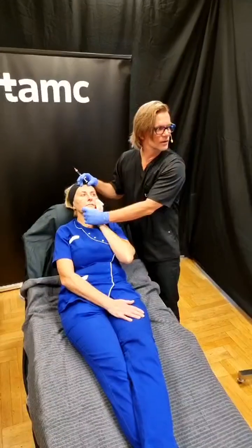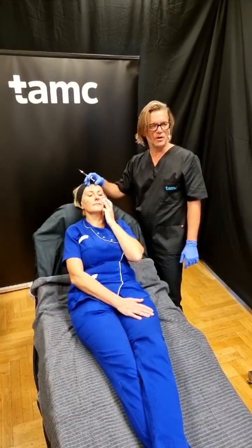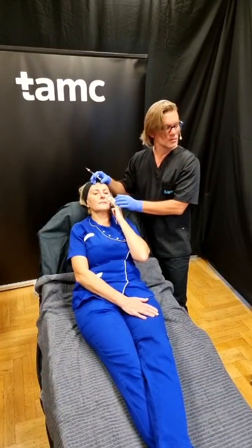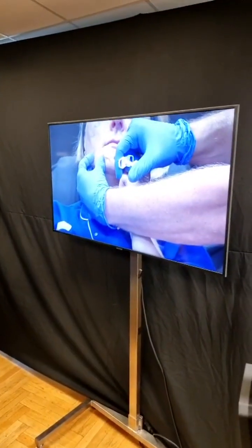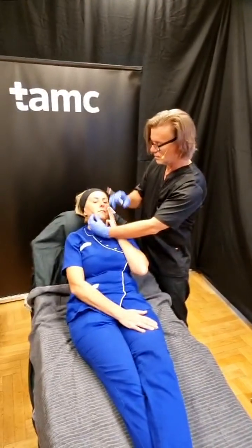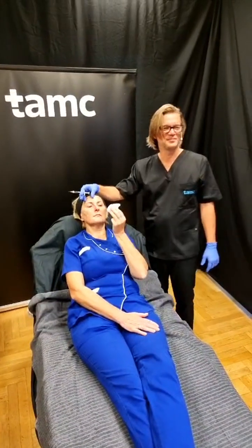These little lines have been bothering her, so off camera I'm going to treat those too. The marionette folds. I'm going to do the classic fern pattern technique on those. But that's another subject, going to do that off camera.